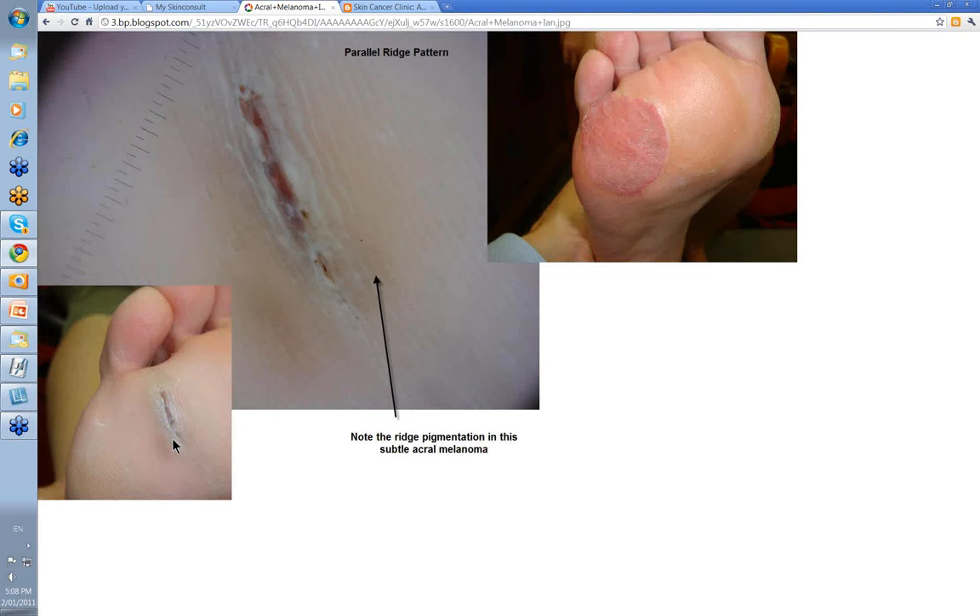This was a pretty subtle acral melanoma. This lady had presented to a podiatrist who trimmed away what was thought to be a plantar wart, but the podiatrist had enough sense to see that there was something else there. When you look closely, you start to see these lines of pigment — pigment in the ridges. These are the broad ridges, with white furrows on either side. So this was a parallel ridge pattern. It was 1.3–1.4 millimeters thick, and she ended up with a large full-thickness skin graft applied to the sole of her foot.